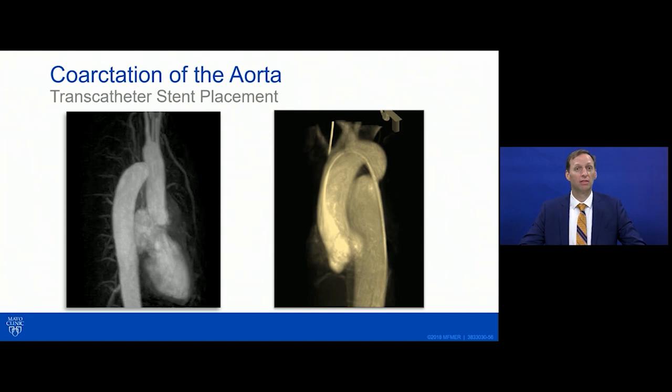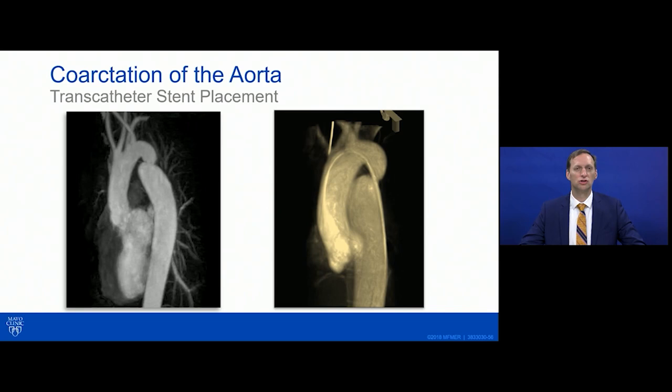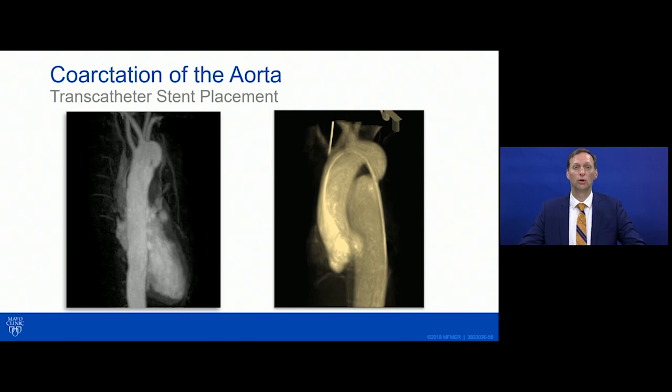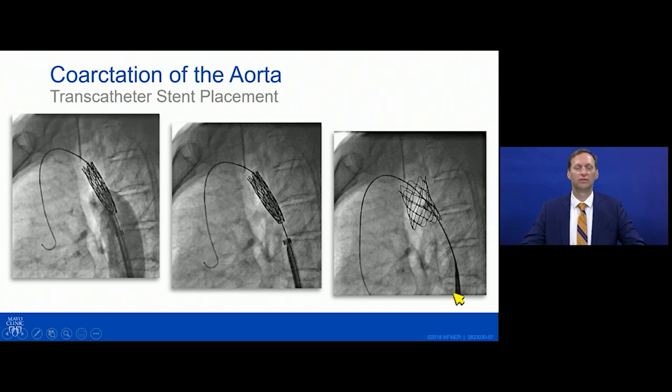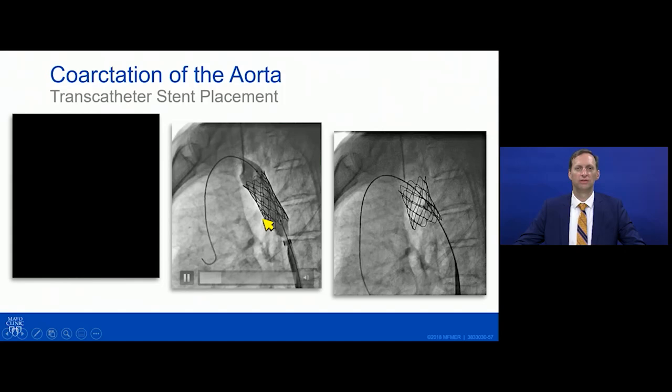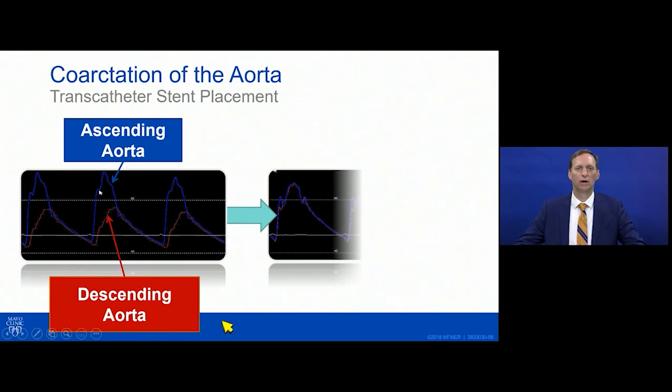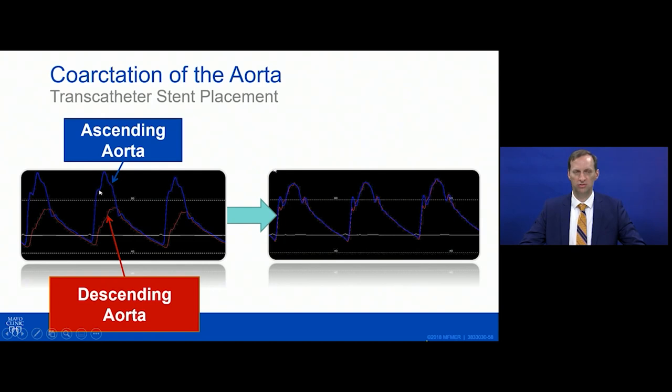In the cath lab: a 52-year-old female with an interesting head and neck branching pattern and a significant native coarctation. A 3D angiogram guided stent placement — a covered stent was deployed with rapid right ventricular pacing. The result was gratifying: a gradient of 40 mmHg became essentially zero after stent deployment, with angiogram showing wide-open flow through the previously coarcted segment.